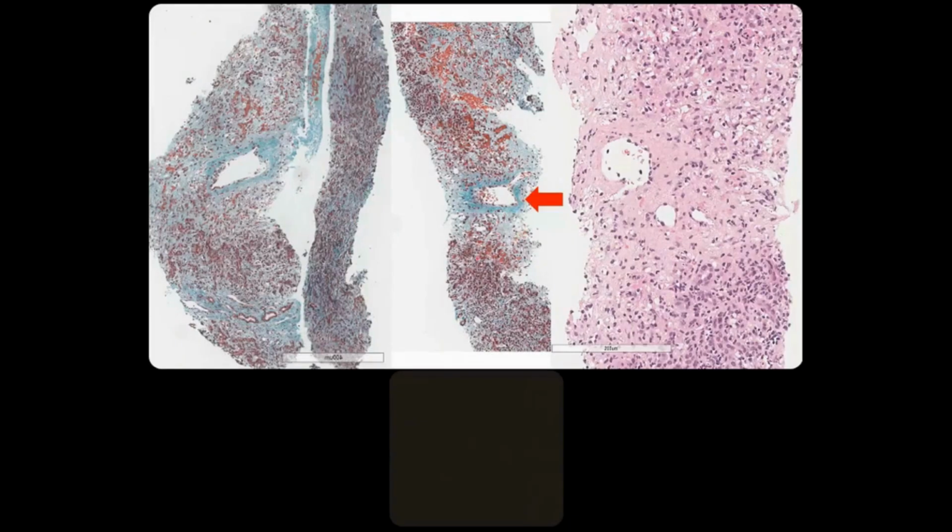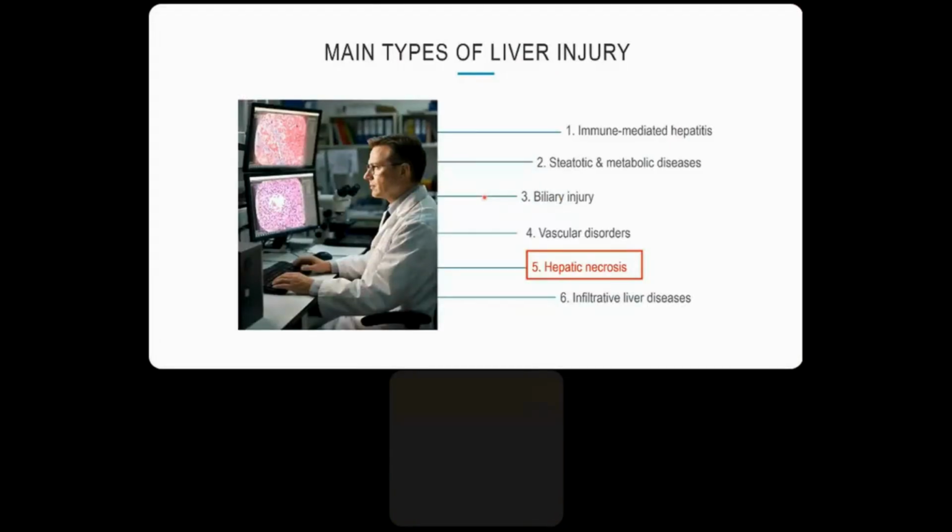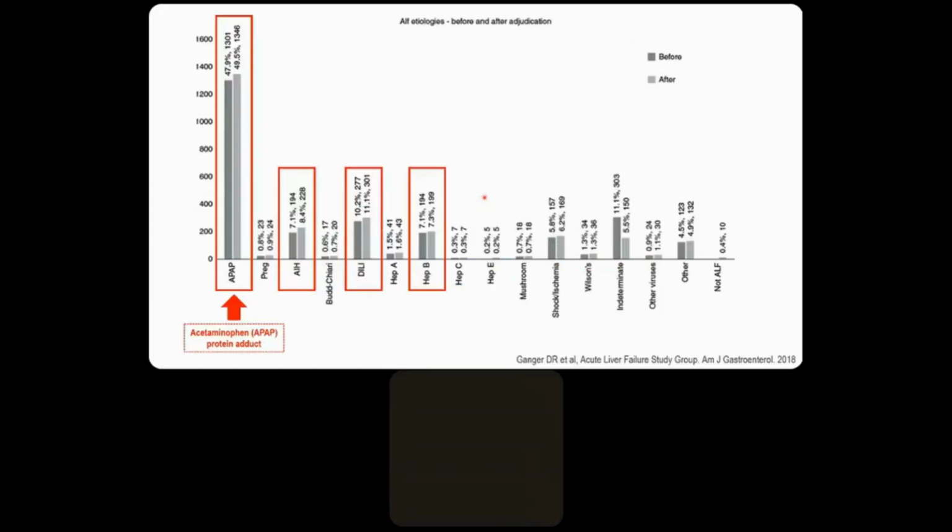Corresponding trichrome stain shows that these areas of parenchymal extinction and collapse stain pale compared to the bright green staining of normal hepatic vein connective tissue. And so this is a classic case of severe hepatic necrosis with parenchymal collapse, which can sometimes mimic cirrhosis radiologically.